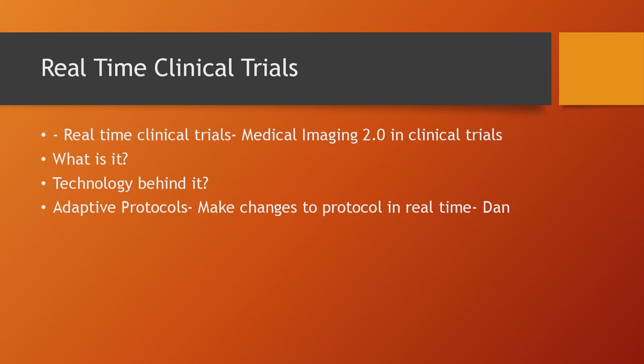And this platform allows things like, as soon as we receive an MRI or CT study from the clinical trial that is ongoing, this study is automatically analyzed using our algorithms, and several imaging biomarkers are extracted from the data. So we are converting the images to data, actually.